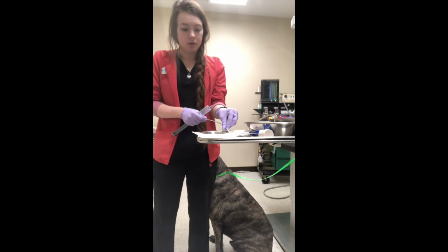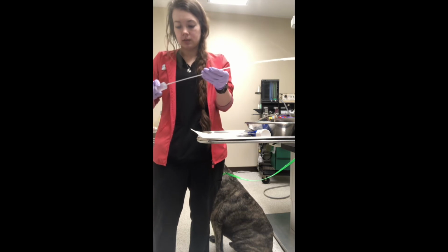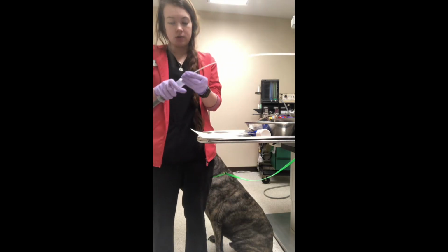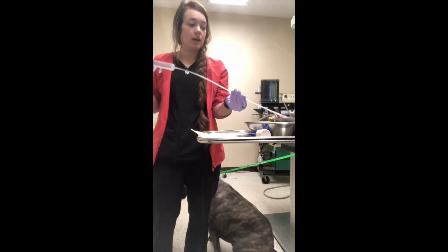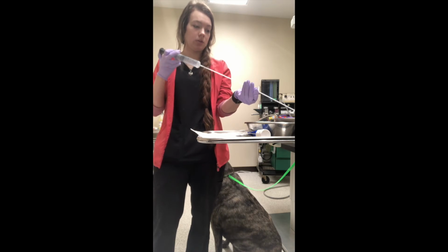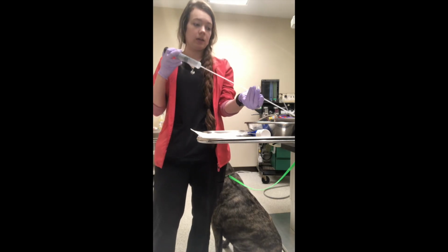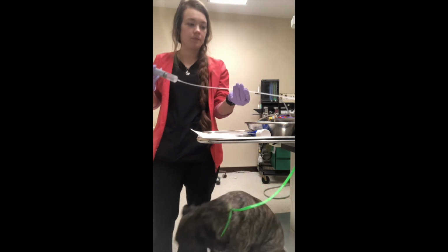Then I'm going to lubricate the end of my catheter well and insert the syringe to the catheter, and then I would insert it rectally and slowly moving it back and forth while administering the enema. And again, depending on the size of the patient, it's going to be how much of the enema we're going to administer.